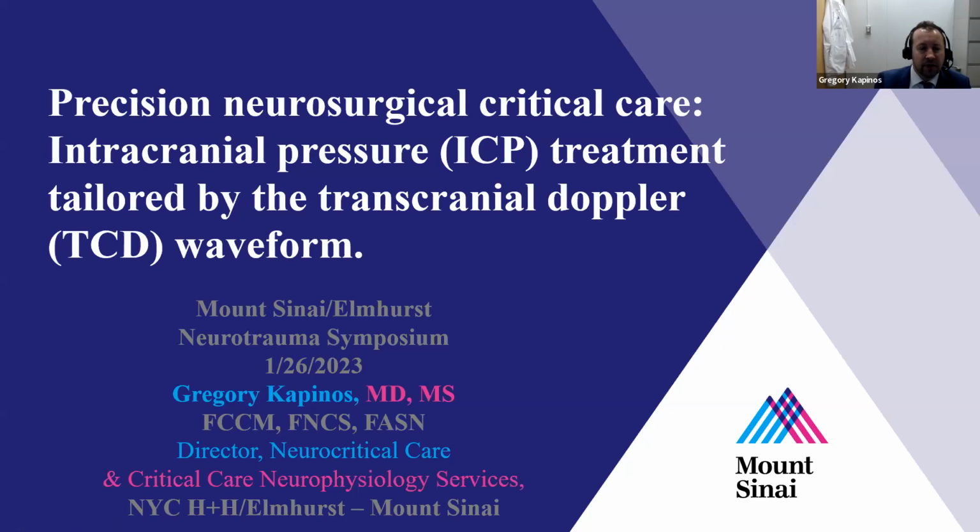Thank you, Dr. Hickman, for inviting me to talk to Mount Sinai and Elmhurst at this joint symposium. The topic, as you said, is on ICP treatment and how we can use beyond what the ICP waveform tells us on the ICP monitor, which is usually a parenchymal or an intraventricular ventriculostomy device.